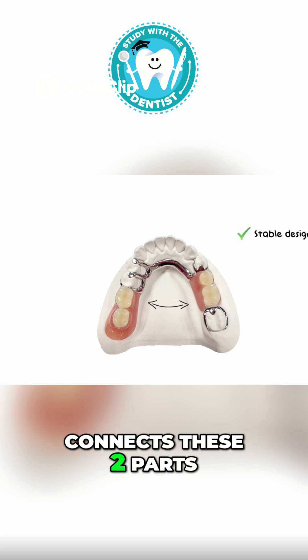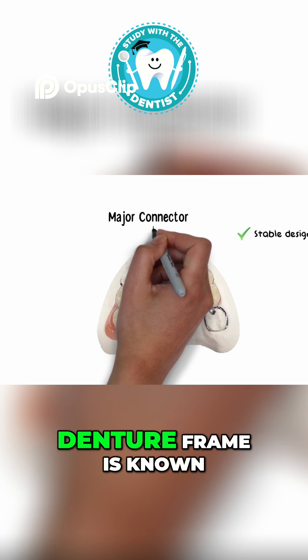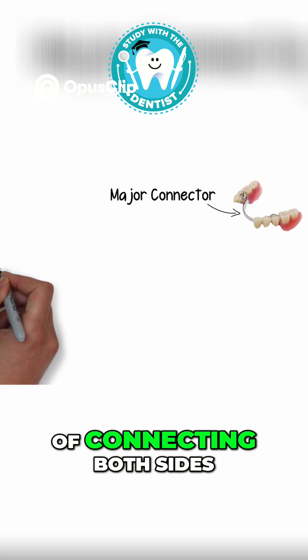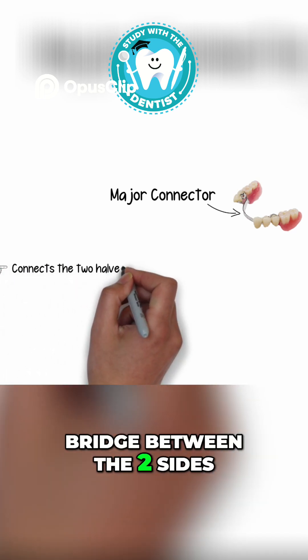The component that connects these two parts — the right and the left halves of the removable partial denture frame — is known as the major connector. A major connector basically performs the role of connecting both sides of the denture bases and acts as a bridge between the two sides.